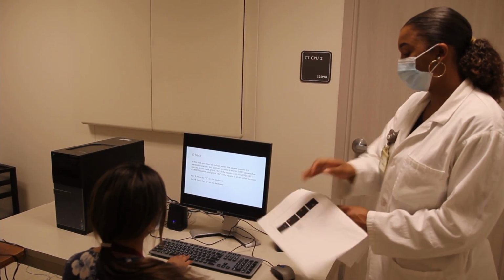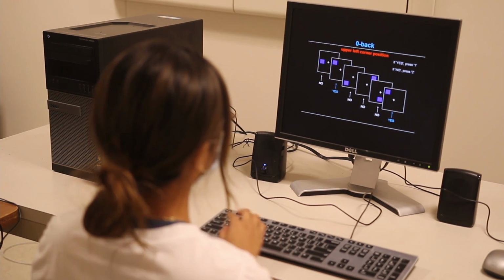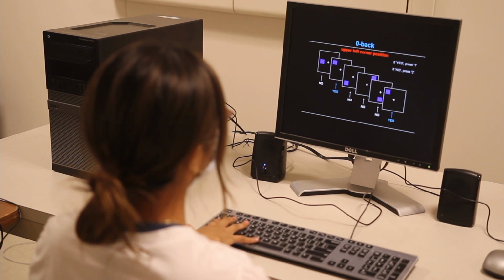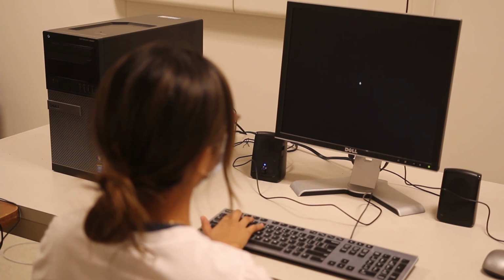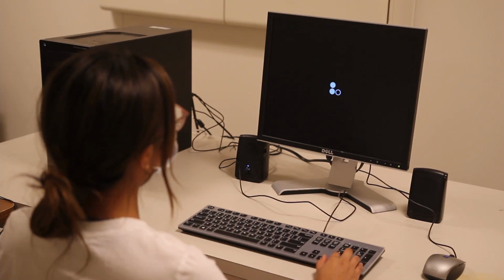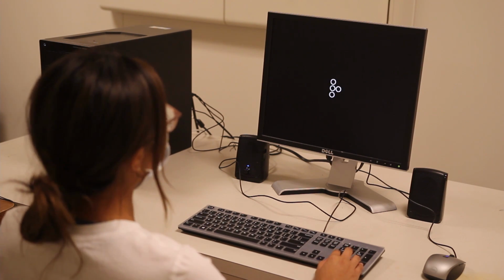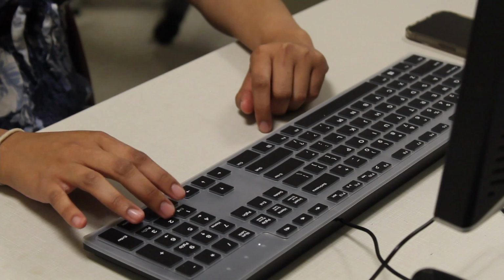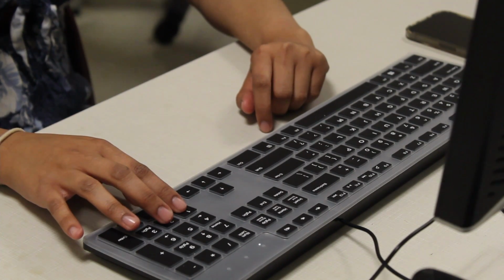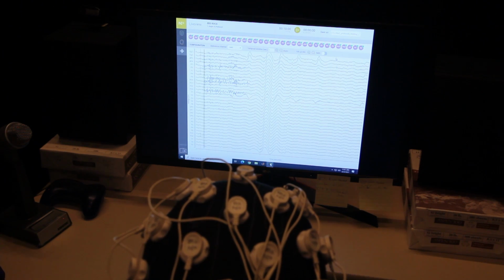During this first task, you will see a sequence of blue squares appearing one after another at different locations on the computer screen. You will then indicate when the square appears in a particular location on the screen. For the second task, you will need to pay attention to a series of dot patterns. You will be shown one dot pattern at a time and then decide whether you have seen the target sequence after every dot pattern. The rest of the appointments are tDCS and EEG sessions.